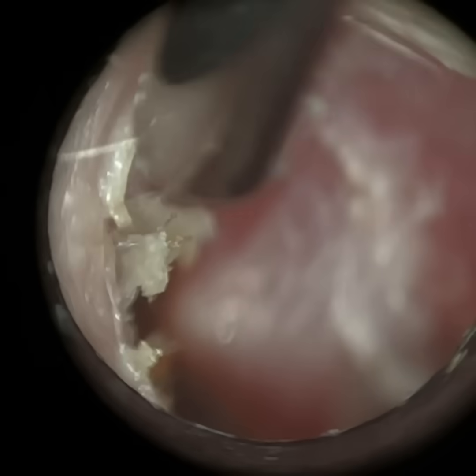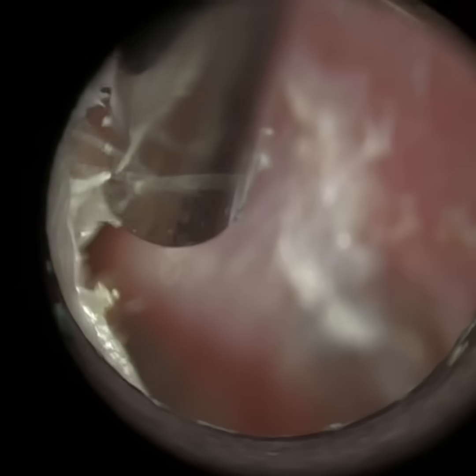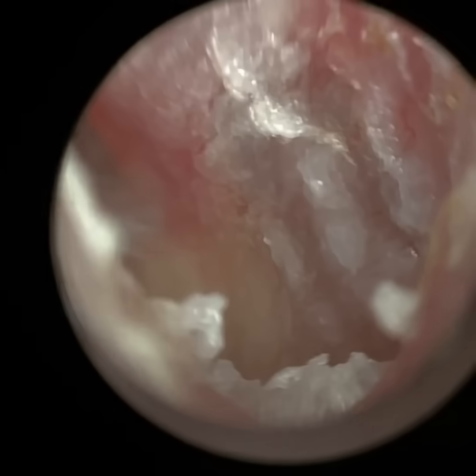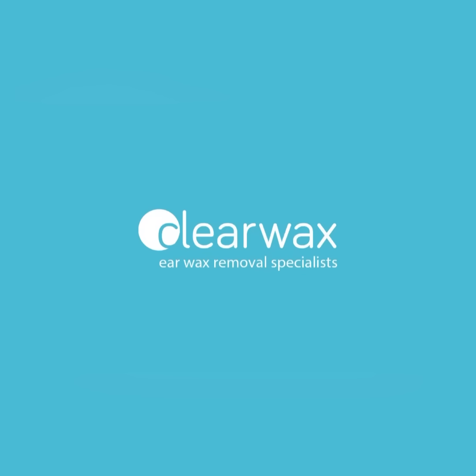There's just a bit on the periphery. There's maybe some evidence of hyphae there, which can occur with aspergillus otomycosis. But it may just be some hairs, because with the magnification even the smallest hairs are magnified. Well, I hope you enjoyed that video. Take care, keep well, and speak soon. Bye.